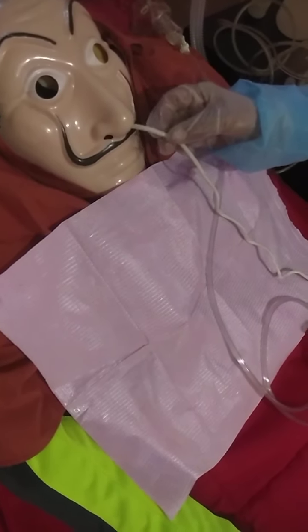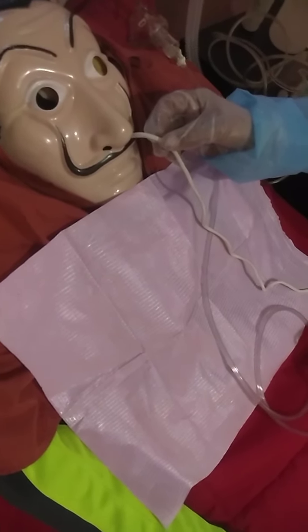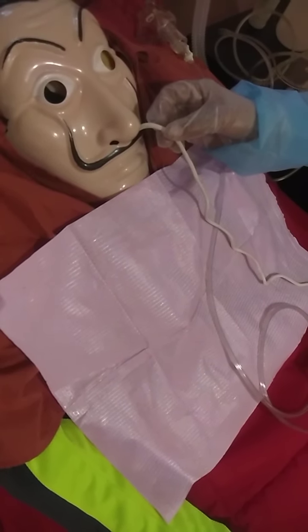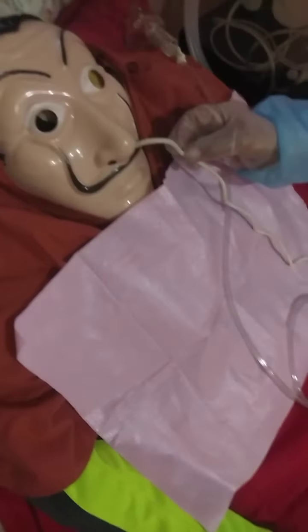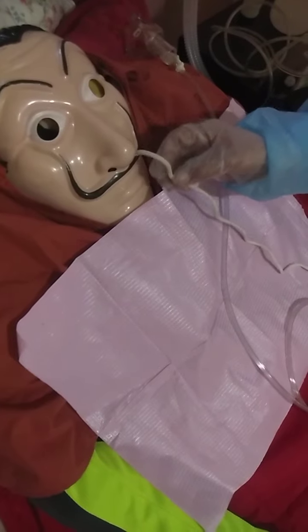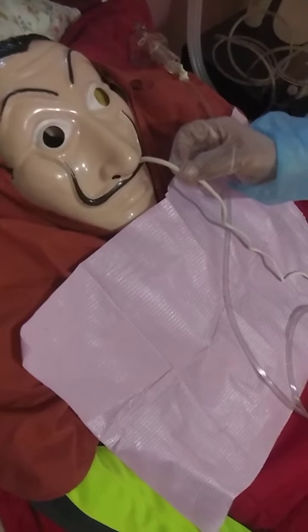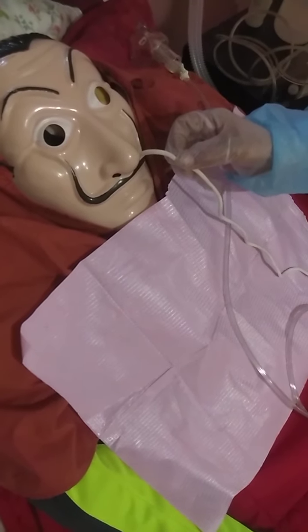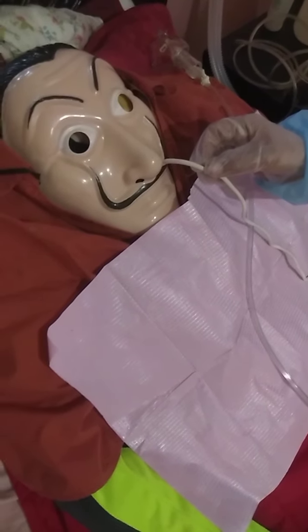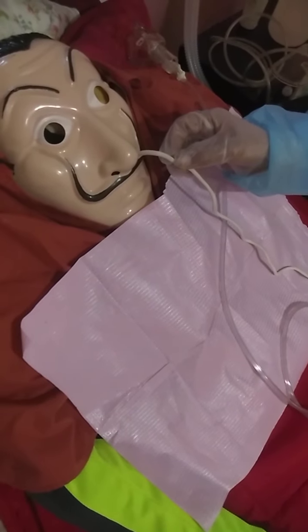In infants and young children, 4 to 7.5 cm, 1.6 to 3 inches. If you're performing nasotracheal suctioning, insert the catheter about 20 cm, 8 inches, in adults; 16 to 20 cm, 6 to 8 inches, in older children; and 8 to 14 cm, 3 to 5.5 inches, in infants and young children.